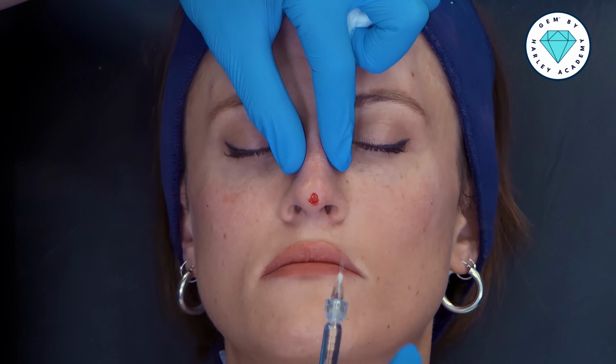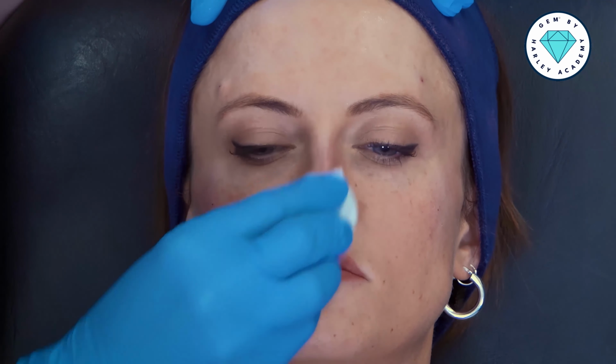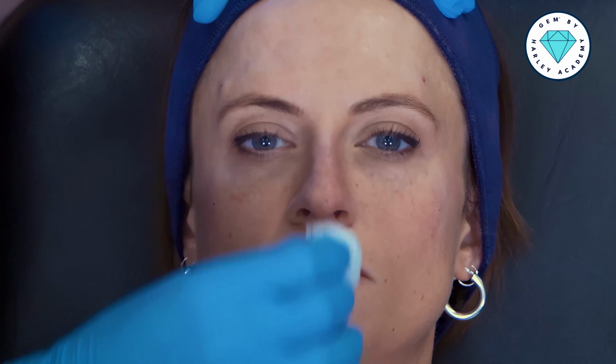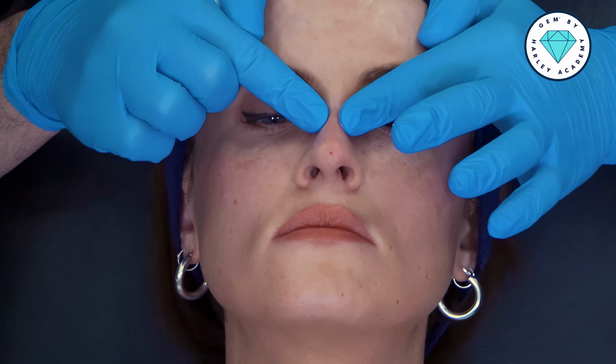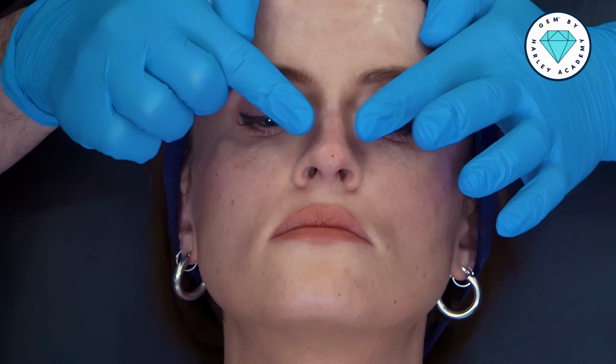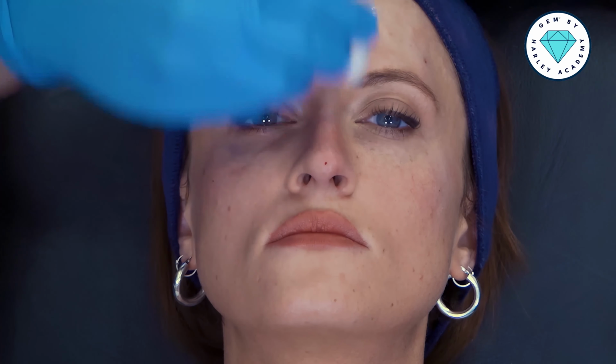And then stop at the tip. And this is the end of my nose treatment. It's worth looking at the top from the patient to see how we've created. I'm very, very happy with the definition and the midline position of the nose.